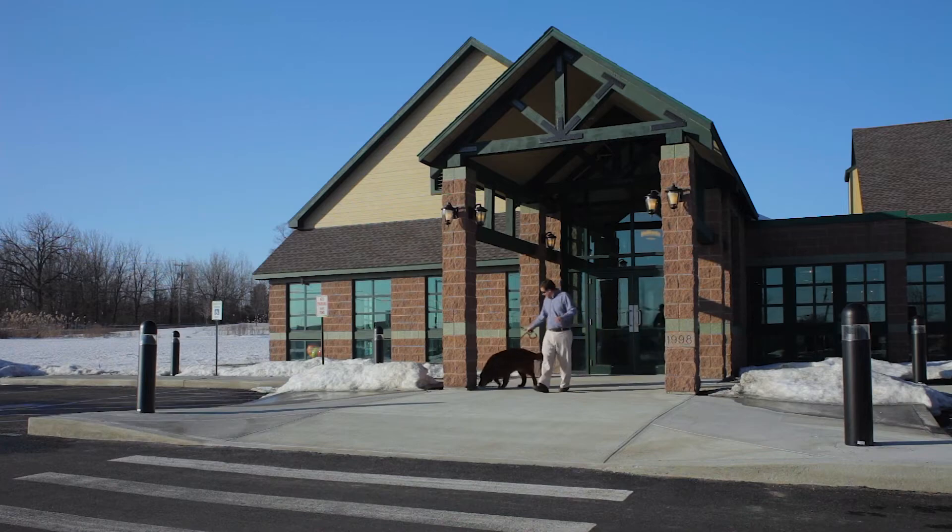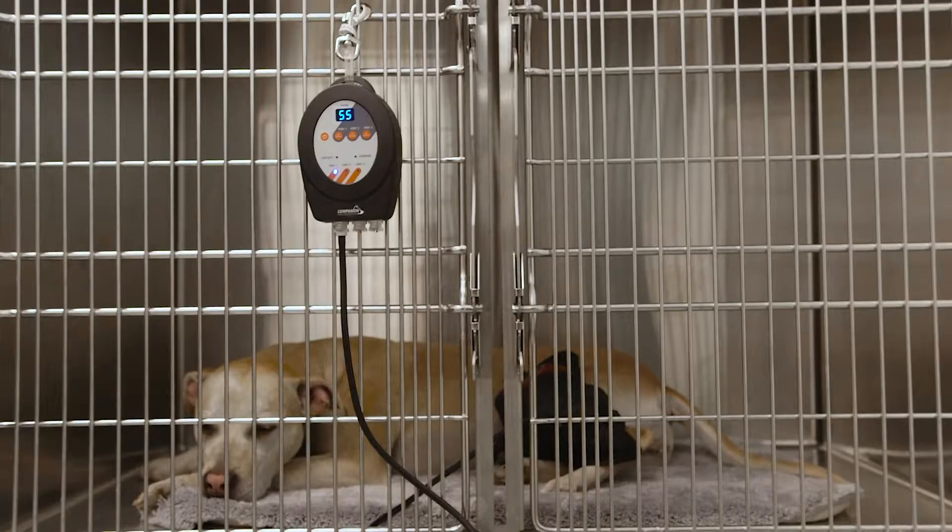To me, the companion cold compression system is a standard of care because of the consistency that it brings us. So not only are we using our companion cold compression system in the operating room and in the ICU following it, but we're also utilizing it as part of our rehab program.